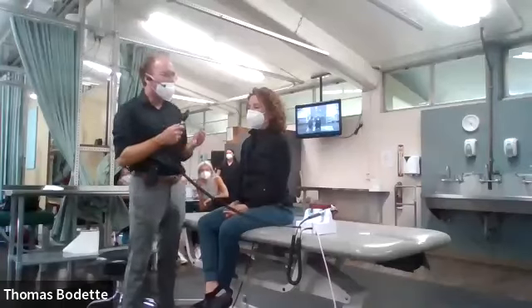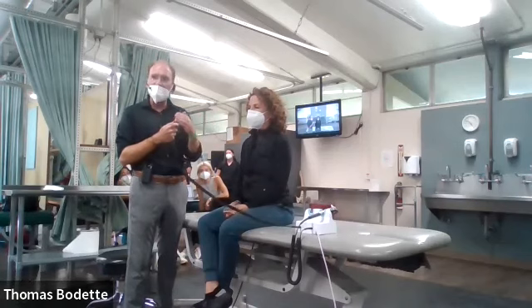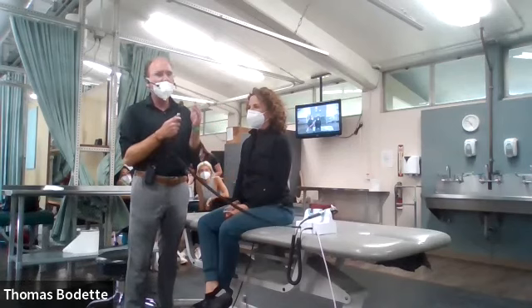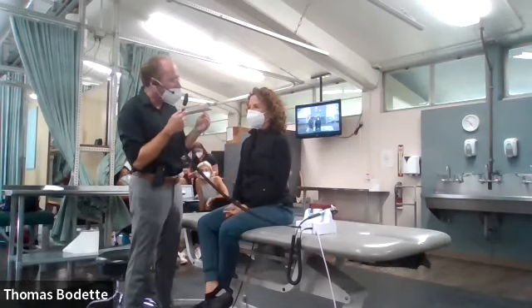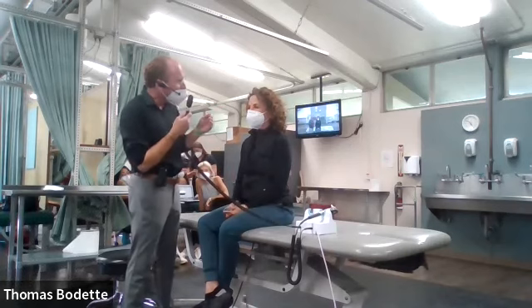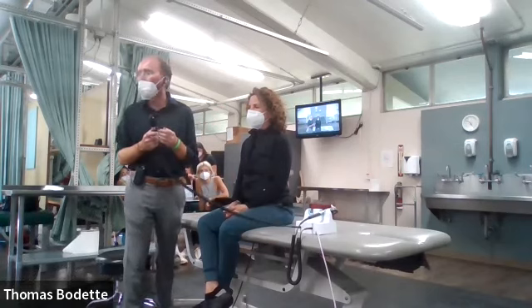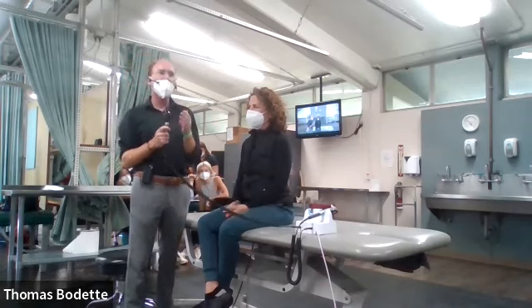So you want to start at about a 28-degree angle and then come in so the patient's not directly staring at the light. That way, when you work your way from the optic cup and disc toward the macula and fovea, that's the only time when you're going to be straight on. Make sense? Additionally, if you're examining the patient's right eye, you need to look through the ophthalmoscope with your right eye, and vice versa for the left.